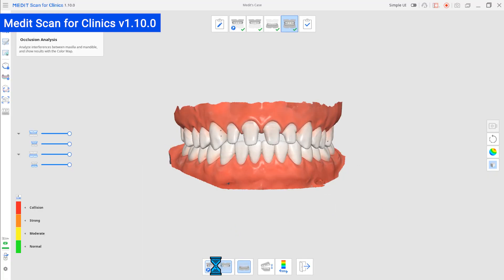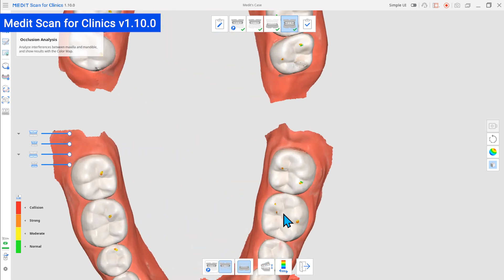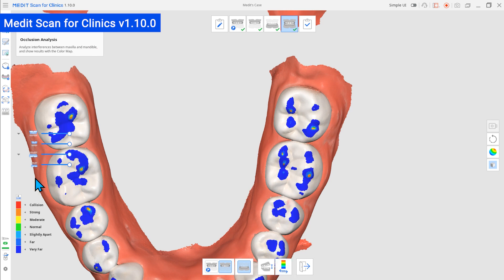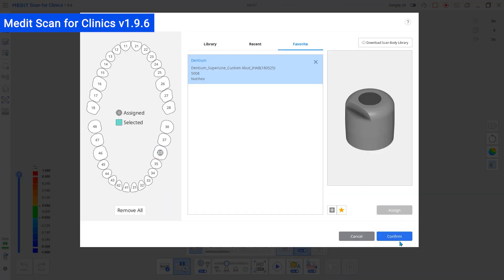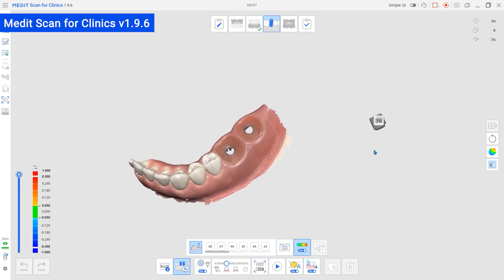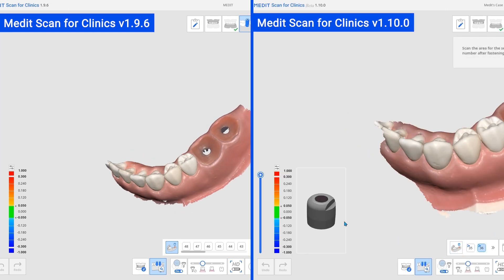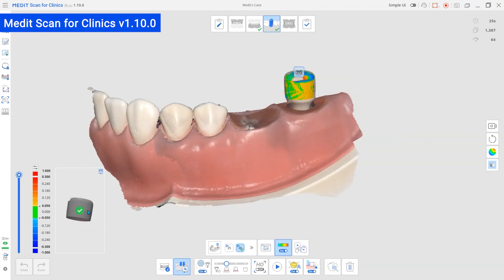Besides, in the new version, you can also change the occlusion targets in the Occlusion Analysis feature. And the color map values are now adjustable. The AI ScanBody matching feature was updated to show the preview of the library data. Check the shape and alignment of the library in the new preview window while scanning.